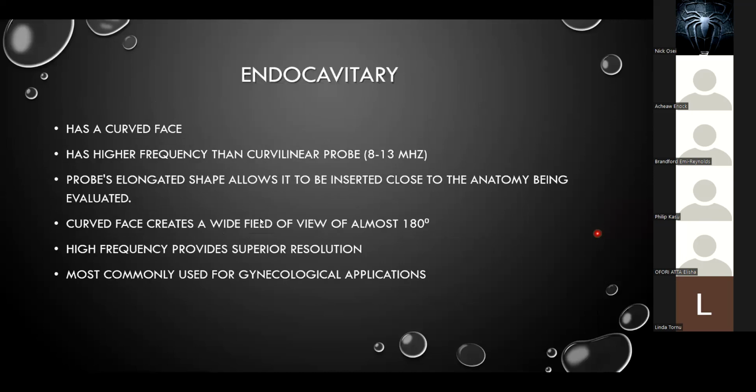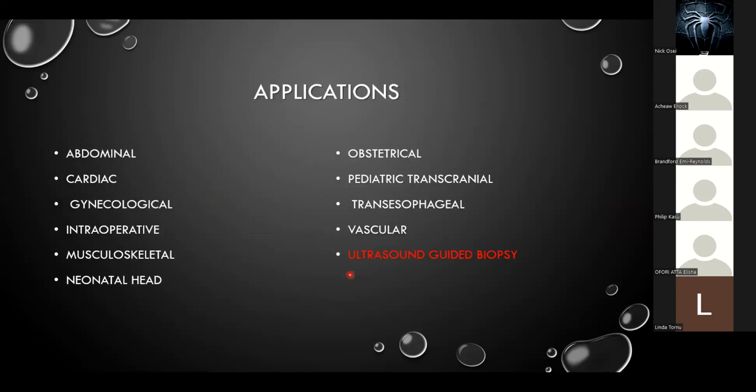So I've added that also here. It's mainly used for gynecological applications. It picks up ectopics much earlier than the ordinary probe. Then I've also added that we use it for ultrasound guided biopsy, just like we do for CT scan. We use ultrasound for the same thing.